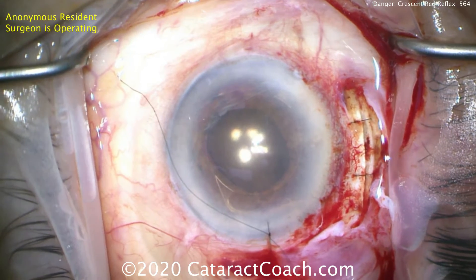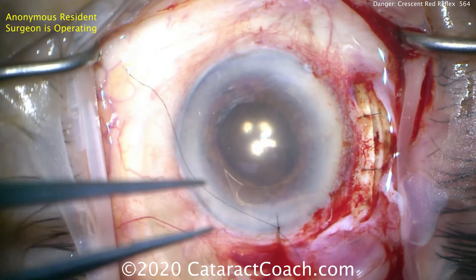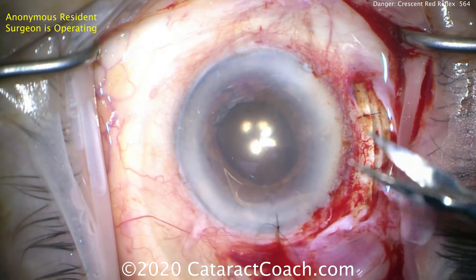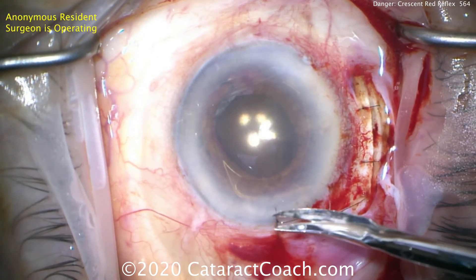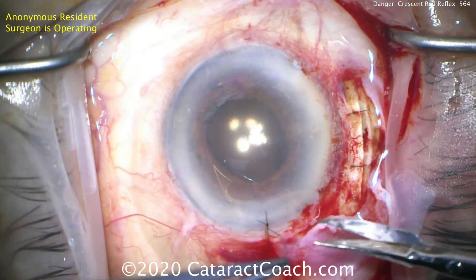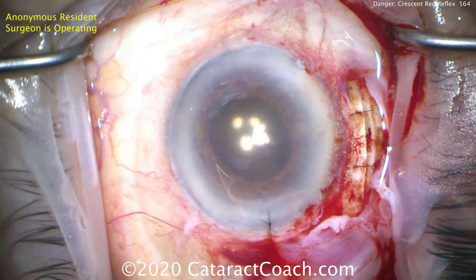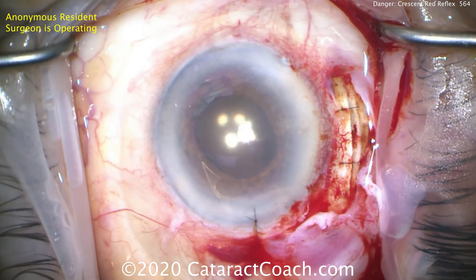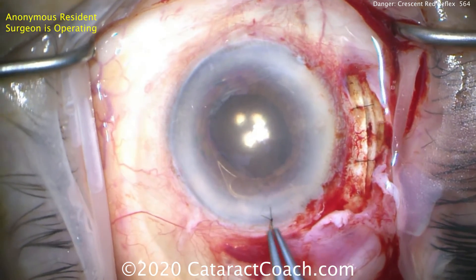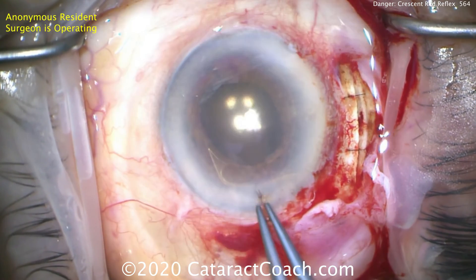And we're going to now finish up the case. There's the anterior chamber lens. You certainly could have done a scleral fixated lens such as Yamane, Agarwal, Scharioth, or any of these techniques. In this case the resident opted to do an anterior chamber lens. Also remember to do a peripheral iridotomy. Everything looks pretty good — here at the end we can see a nicely positioned lens, and we've sealed up all the incisions. This patient will have a pretty good outcome.